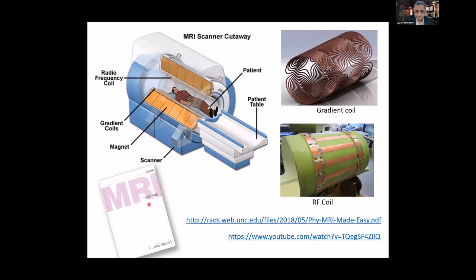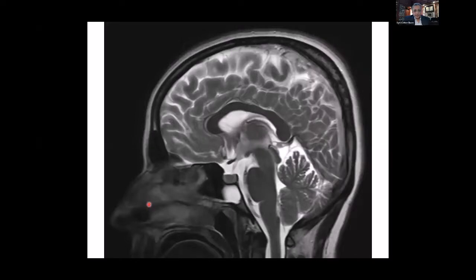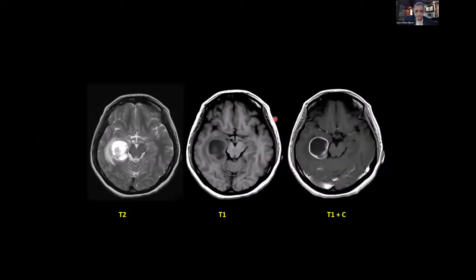Okay, so now coming to actual MRIs. This is our T2 weighted image, and we can get all the details. Actually, I should go to this one. The most basic ones are the T1 weighted image, the T2 weighted image, and T1 with contrast. These are the basic images that we get. When we do the screening MRI, we only do T2 weighted images, just on one plane. A study was done at AKU which showed that this is good enough to at least tell people if there's any abnormality. Not very accurate, but it cuts the cost significantly.